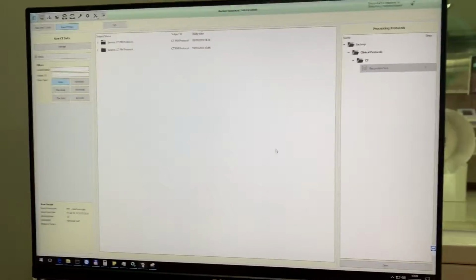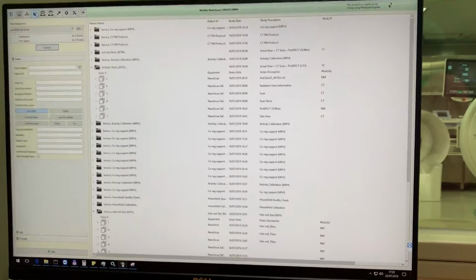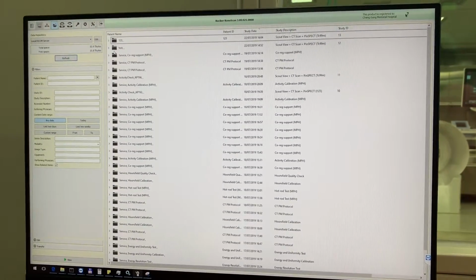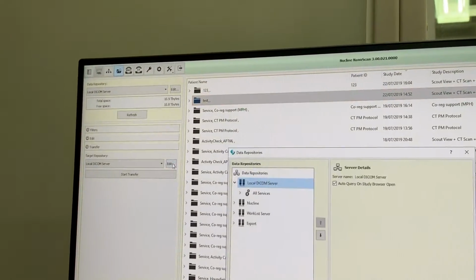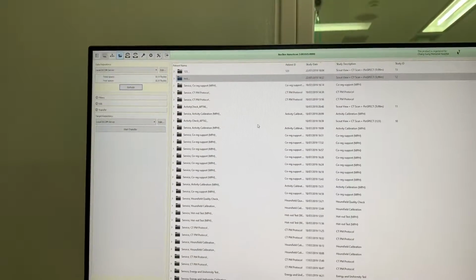So, yeah, because we are logged in via the TeamViewer, right? This is why we see that here. But here we have actually the same. Let's do it. Yeah, any date. So we have here the same study list or the same DICOM list. So you can do it from here as well. But here we have not created that target repository, so you can do it on the workstation. This is for this computer. Yeah, this is this computer.